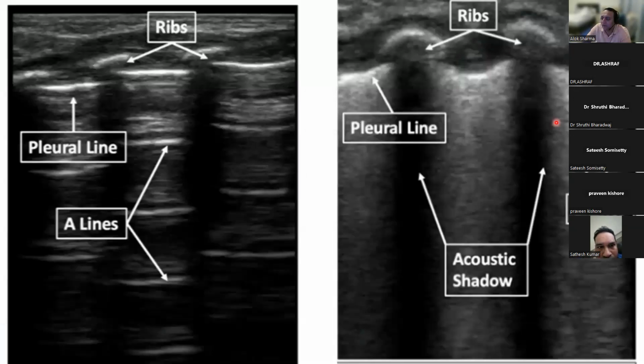Now, in terms of our approach, lung ultrasound is incredibly helpful because it's very objective. I mean, there's no doubt that this is well aerated lung, and there's absolutely no doubt that in the right clinical context, this is pleura that's blurred. There are, with the eye of faith, subpleural consolidations that are visible, and you've got a B profile. So objectively, the diagnosis of RDS can be made more effectively using lung ultrasound.